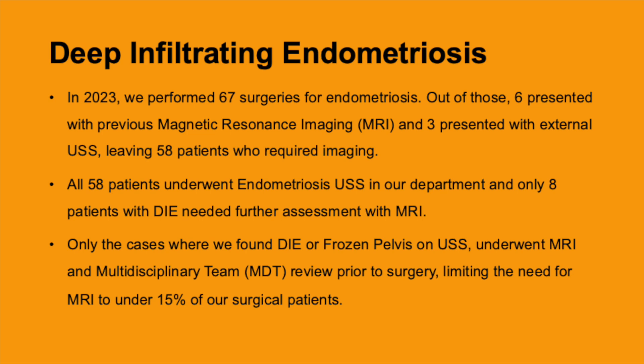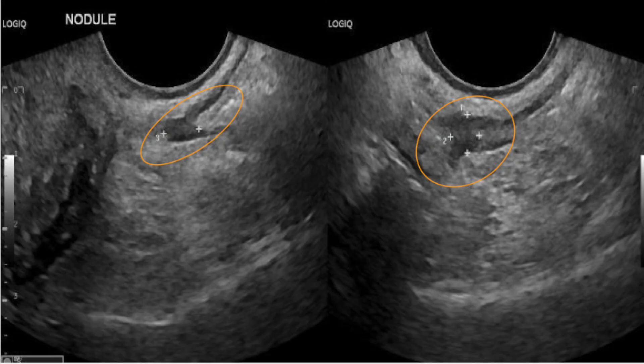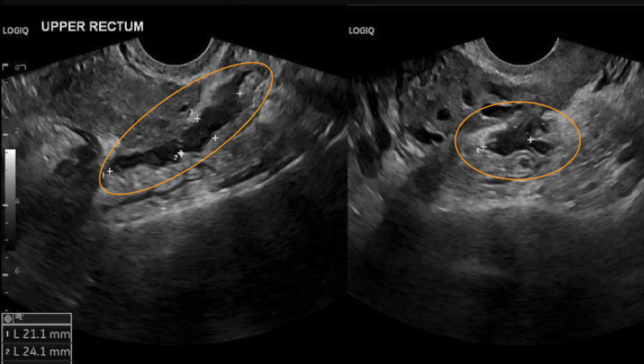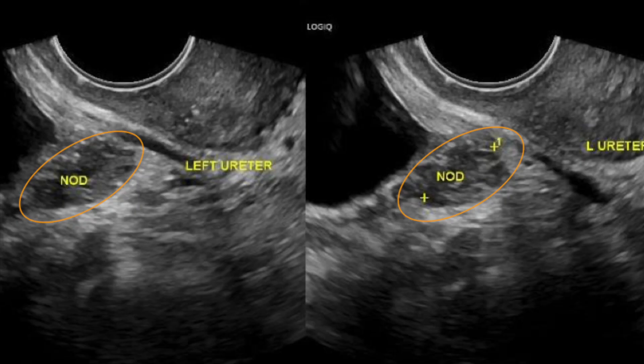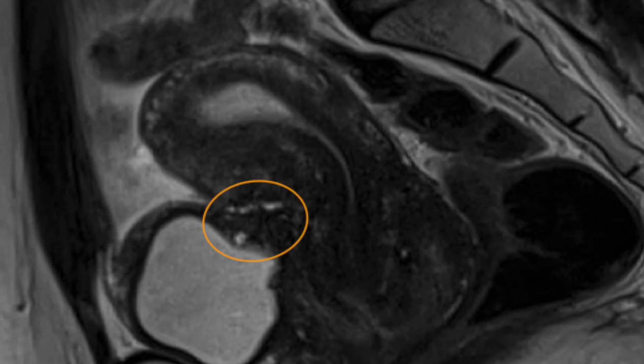This demonstrates that under 15% of our surgical patients now require MRI, helping to reduce the burden on the MRI department and MDT workload prior to surgery. Here we can see a large rectal nodule — and another patient with a large rectal nodule, which some would say is even better demonstrated by ultrasound compared to MRI — diagnosed preoperatively. Looking at the anterior compartment, we can see a lady with a large bladder nodule and the corresponding image from the MRI scan.